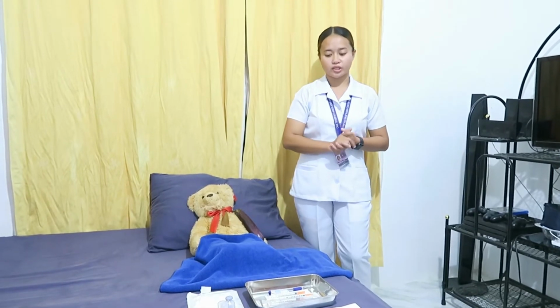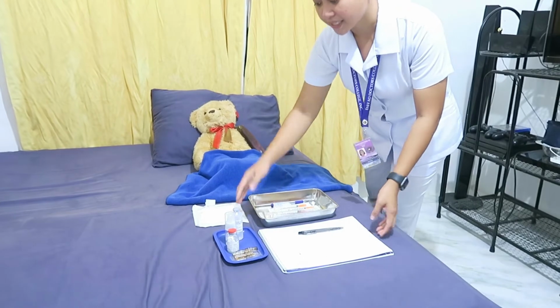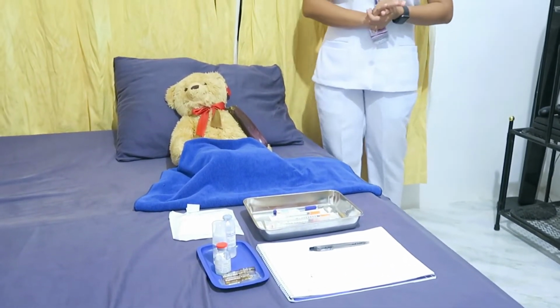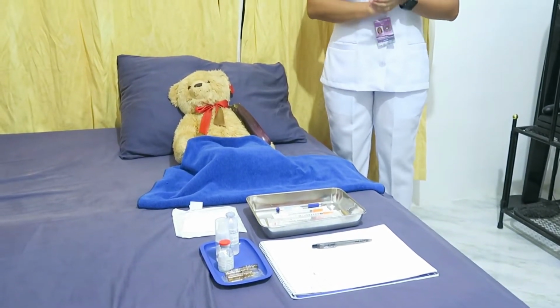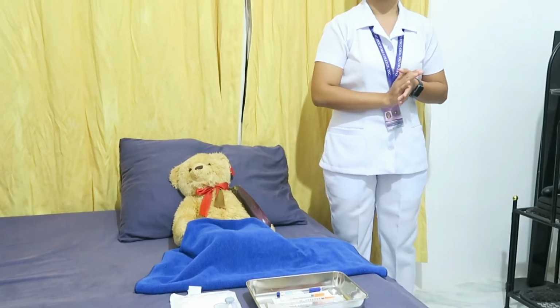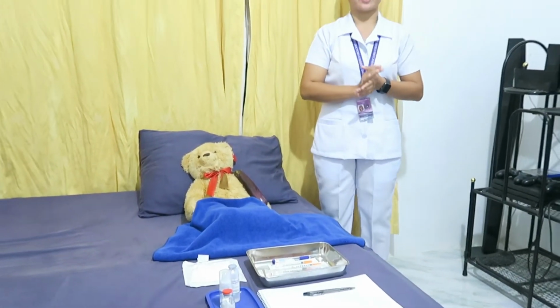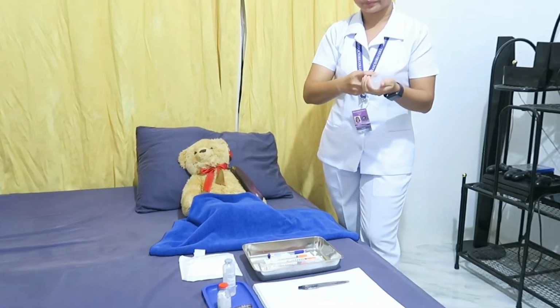Next is to organize the equipment. The rationale for this is to save time and effort or energy. As you can see, I've already organized the equipment. So let's proceed to the preparing. Before starting the procedure, perform hand hygiene and observe other appropriate infection prevention procedures. This is to prevent the spread of microorganisms and to organize work. So, I'm going to sanitize my hands.